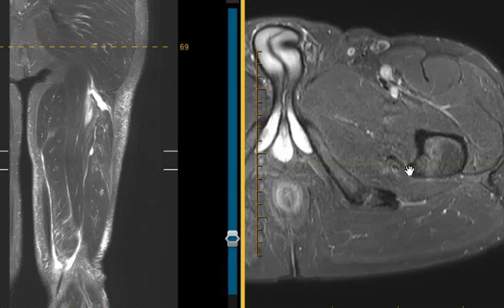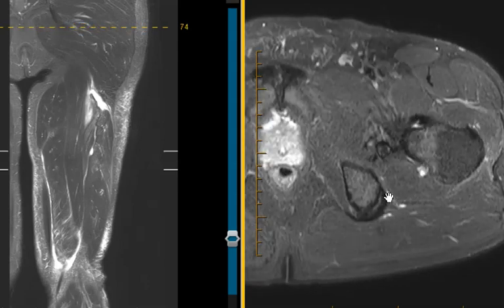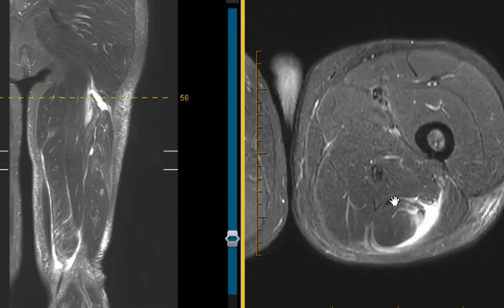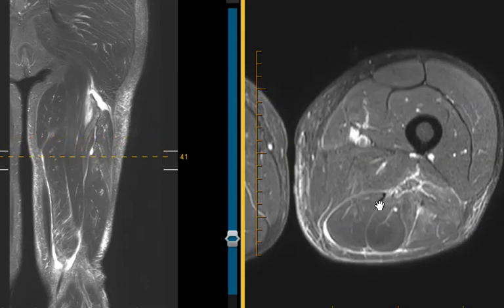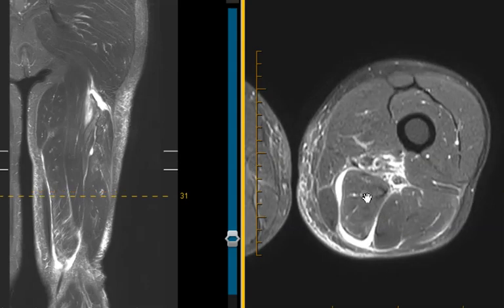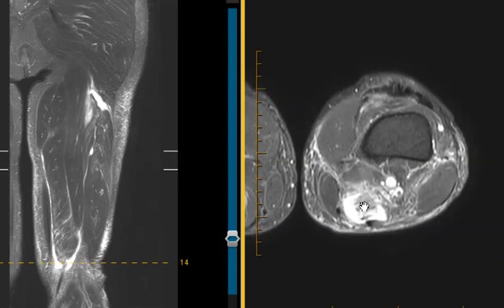Now we're going to take a quick look at the anatomy. Here's the lateral side up high — we're going to follow this dark structure, and it should go to medial down low. This should be the semimembranosus. We follow it down, and you can see how it switches over from lateral. Here it is right here — that dark band — and this is the muscle. The semimembranosus is the most medial muscle of the thigh distally. And right here, this brightness is the tear — the ruptured musculotendinous junction.